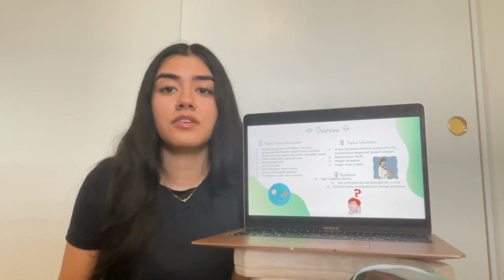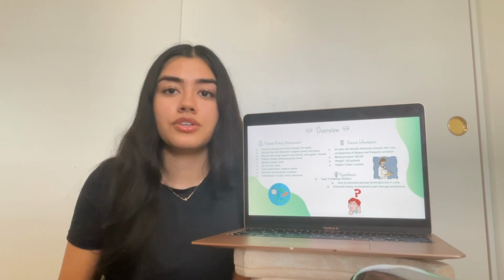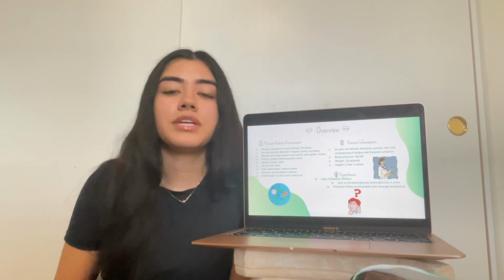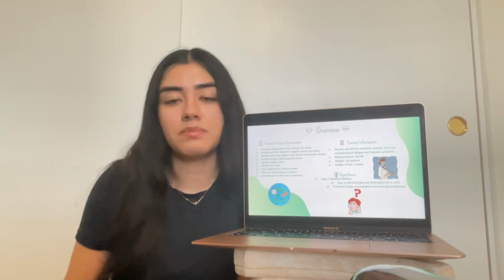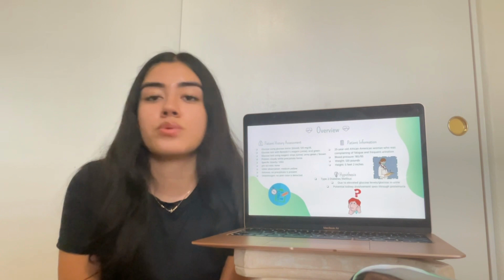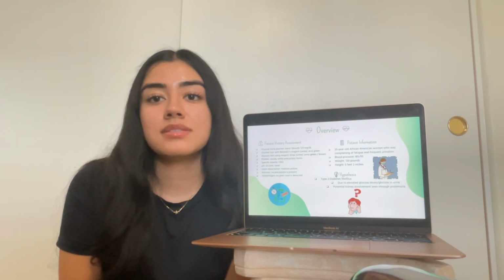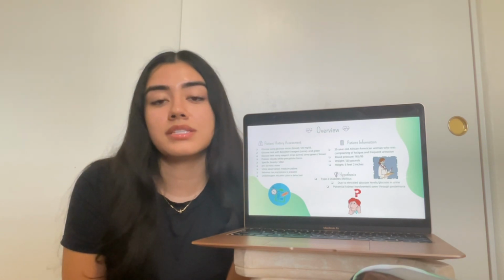Interestingly, the absence of precipitates in the ketone test and the lack of pink color in the urobilinogen test suggest relative stability in the patient's metabolic state, possibly excluding certain liver or metabolic disorders. The pH level, which is 6.0 in the urine, while likely within the normal range, would need further evaluation. Meanwhile, the absence of ions points to the absence of several electrolyte imbalances during testing.